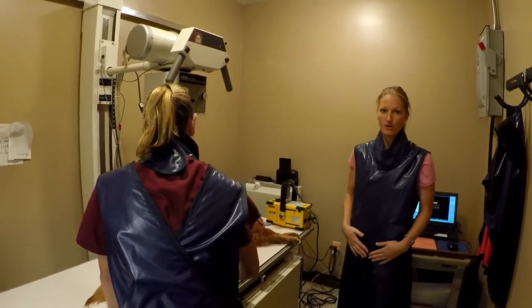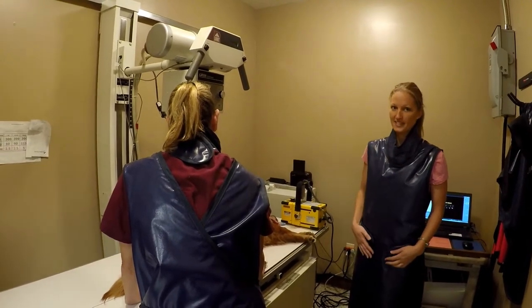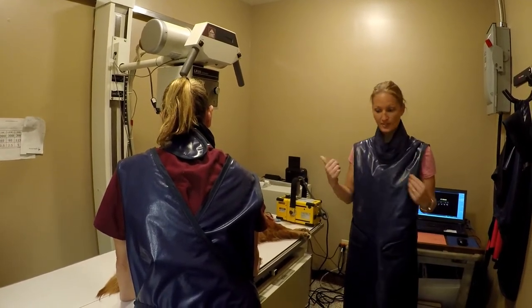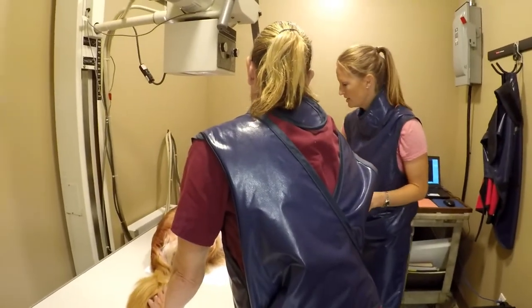We want to see what the extent of her arthritis is in these hips. She is sedated — she just had a little surgery, so this will make it a little bit easier. We do have our lead aprons on and our thyroid shields for protection.